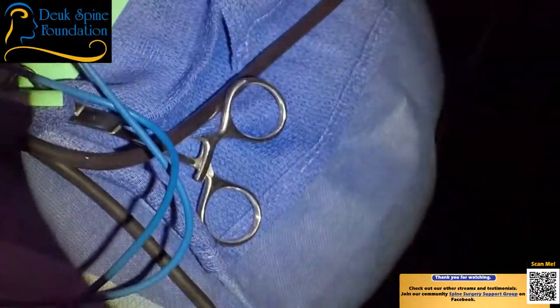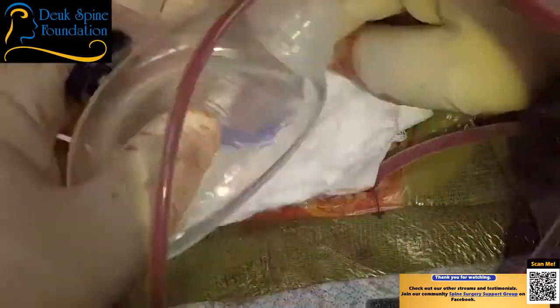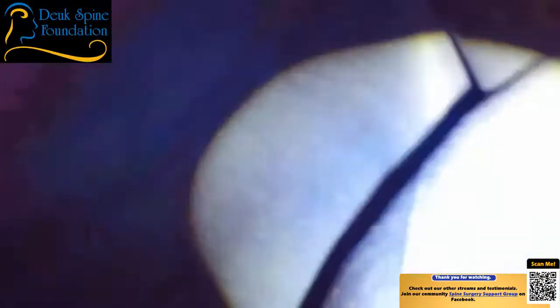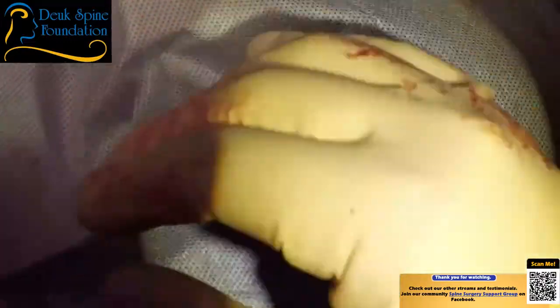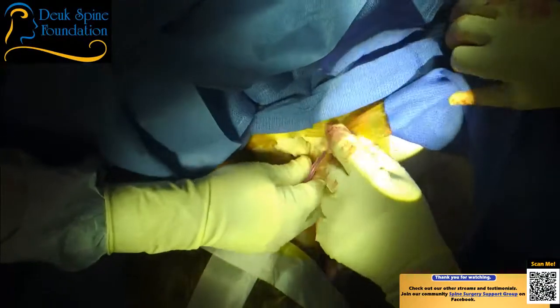All right, you guys ready for the drapes to come down? Hold your hand there. Hold it right there. Let's go, drapes down. Watch the tube. I don't want to pull the tube out. I need the scissor back in a minute. Everybody watching the tube? The endotracheal tube. I need the bed ready to come in.